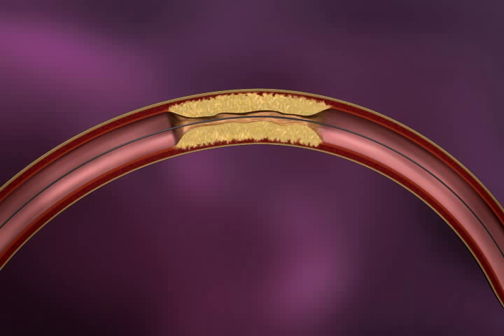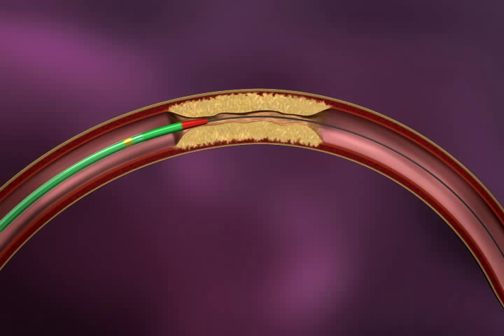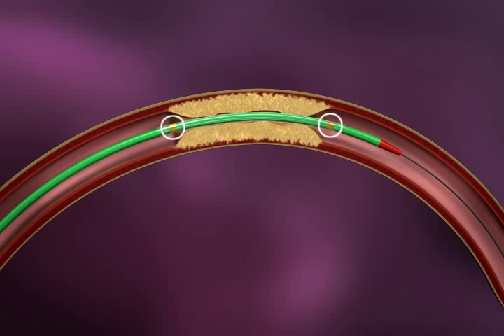Advance the Gateway PTA balloon catheter over the exchange length guide wire until it reaches the stenosis. Cross the lesion with the balloon catheter and position the catheter relative to the lesion to be dilated. Marker bands on the balloon will help guide positioning.